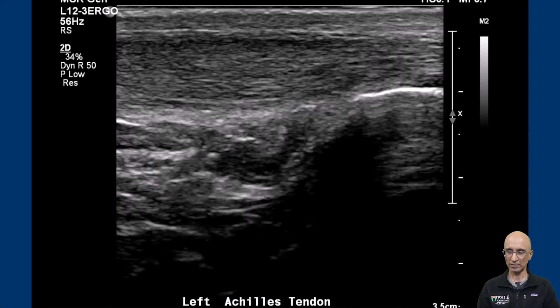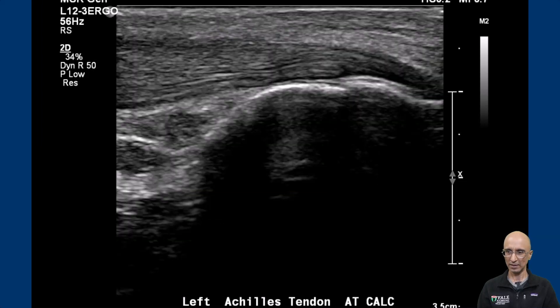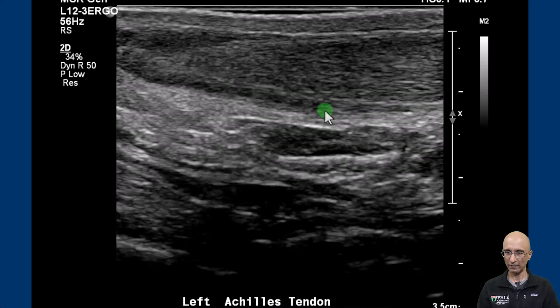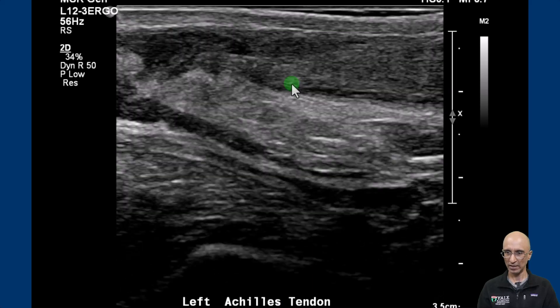As I scroll through the ultrasound images you can see the insertion of the Achilles tendon into the calcaneum. We are scanning superiorly from the insertion point. As I go further you can clearly see a soft tissue defect filled with fluid and echogenic material, approximately five centimeters from the attachment of the Achilles tendon to the calcaneum.